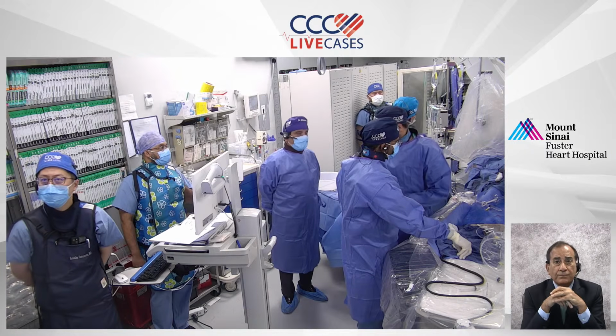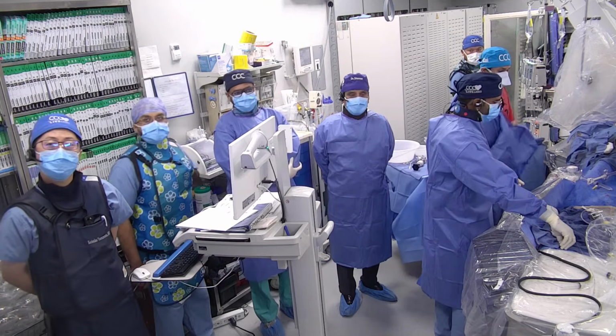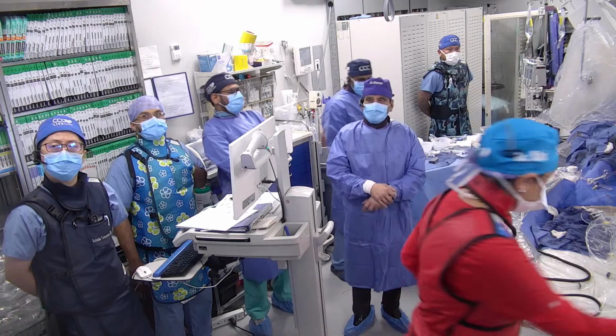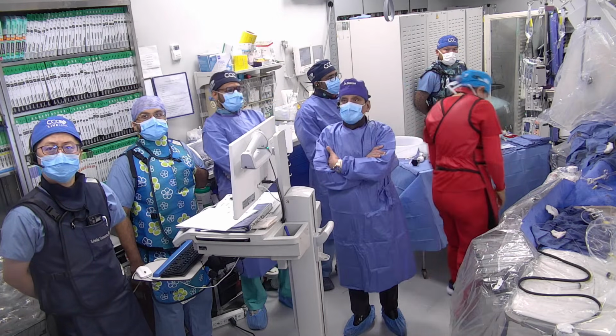Okay. Yeah. And as you know, many times, almost the October trial showed, once you do OCT, almost 18% of cases, you either go through the strut or behind the struts. And so clearly stent deformation is a reality, and we should be very cautious about it, particularly when you're using imaging.